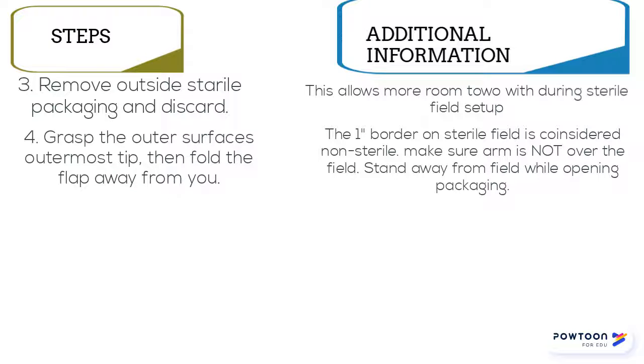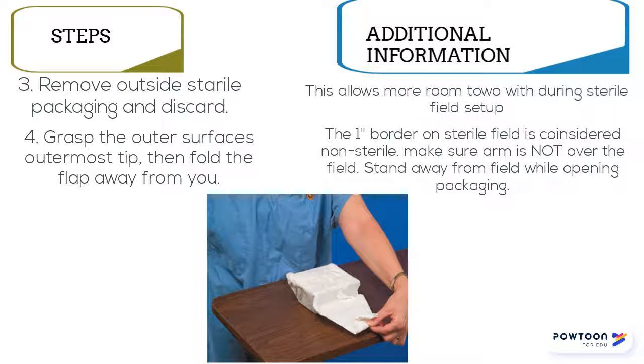Grasp the outer surfaces with the outermost tip, then fold the flap away from you, taking care not to reach over the sterile field as you will contaminate it. Remember, the 1-inch border on the field is considered non-sterile.